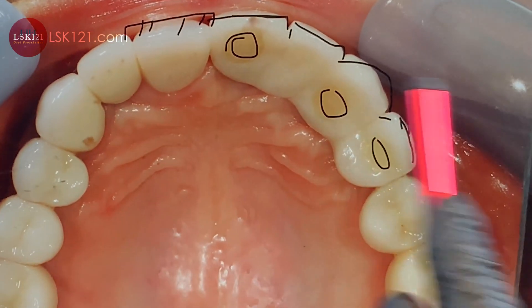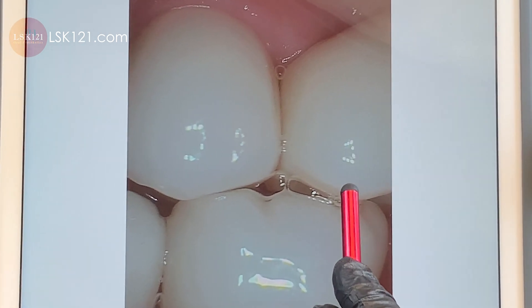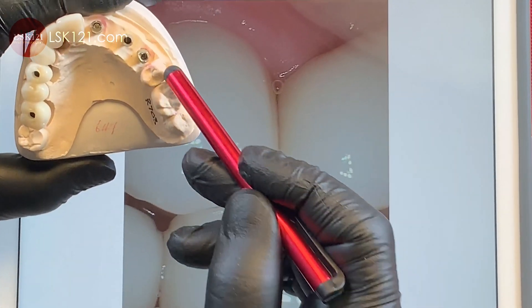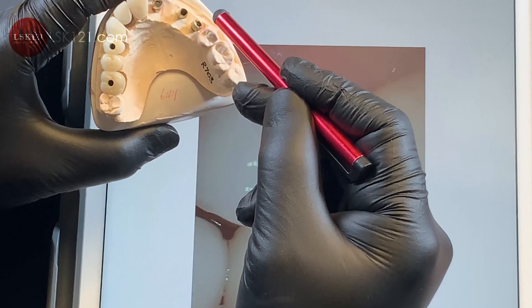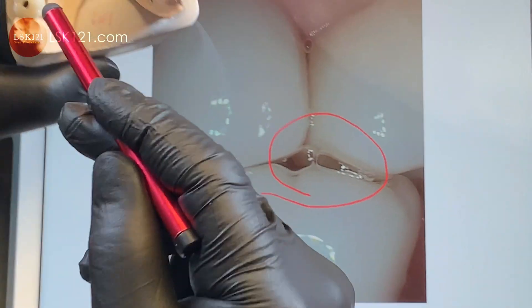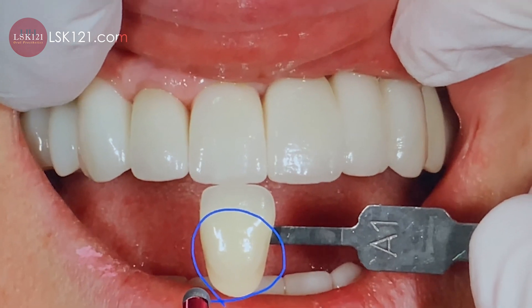Canine and premolar — then we can finish it. This is the good guideline due to the patient's remaining natural teeth or existing restorations. This is the guidance for occlusion — occluding here to there. I have to put all centric contacts along with the lower.